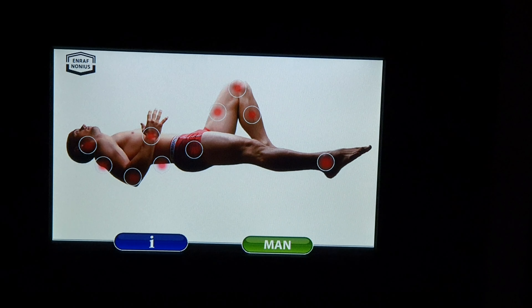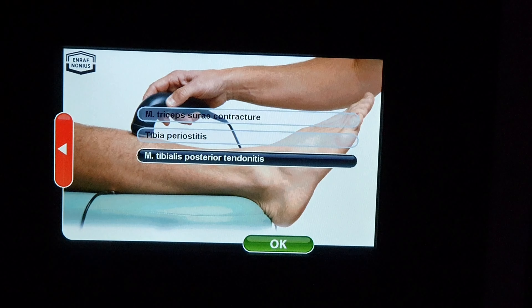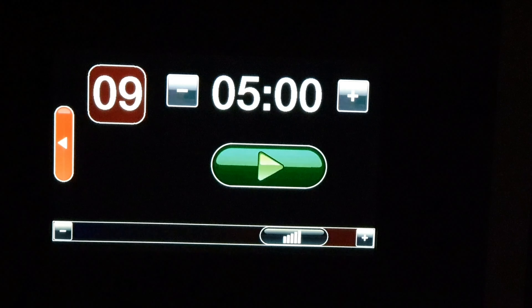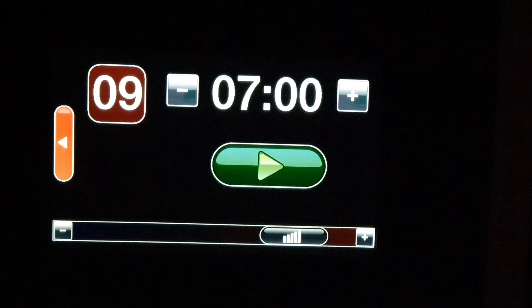Today I'm going to be treating the calf with the Tecarpuls from Enraf Nonius for Tibialis Posterior Tendinitis. The machine has pre-loaded the intensity at level nine, which is nearly its top level — level ten would be the top — and five minutes as the amount of time to do the treatment for.